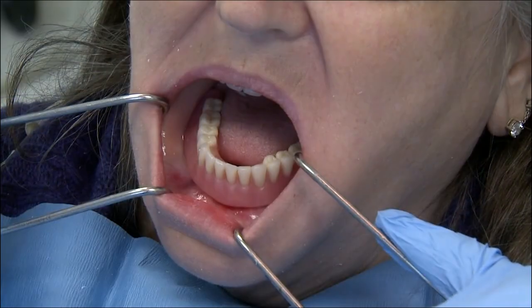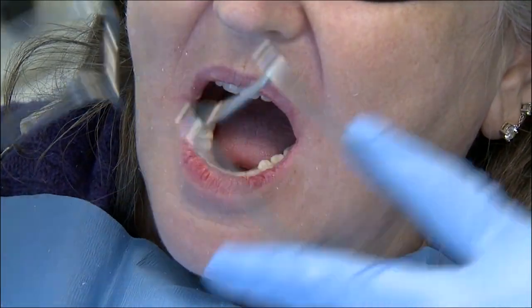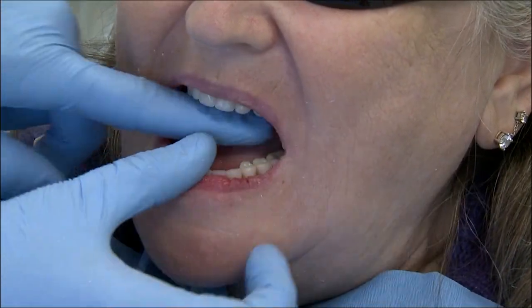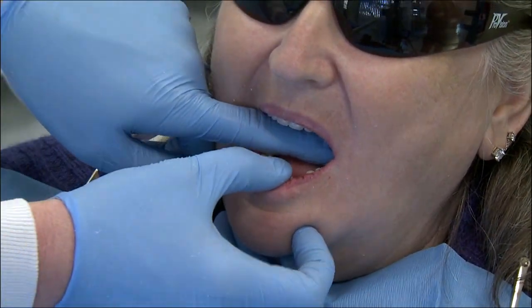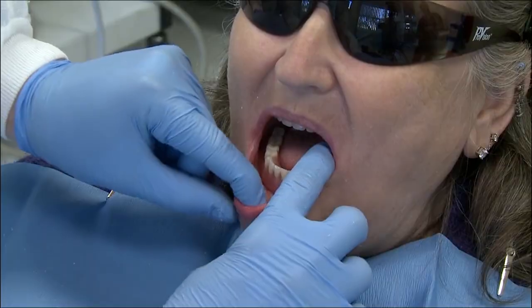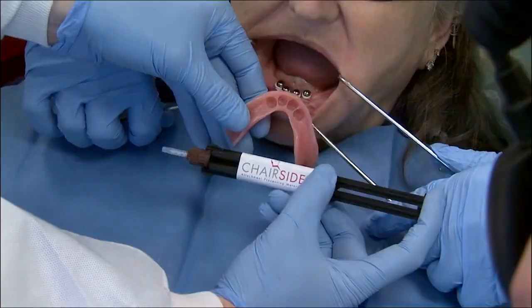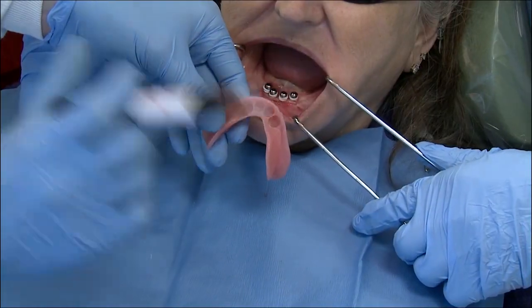Once we've prepared all of the recesses including the vent hole and undercut, I try the denture back in the mouth, verifying that the patient feels comfortable. Nothing feels like it's rocking as I push side to side. The patient feels comfortable, their bite feels normal, and they feel like their denture is no different with the implants in place. After verifying the proper fit of the complete denture to the edentulous ridge, I've checked that the locator denture caps and the block out spacers are in place.